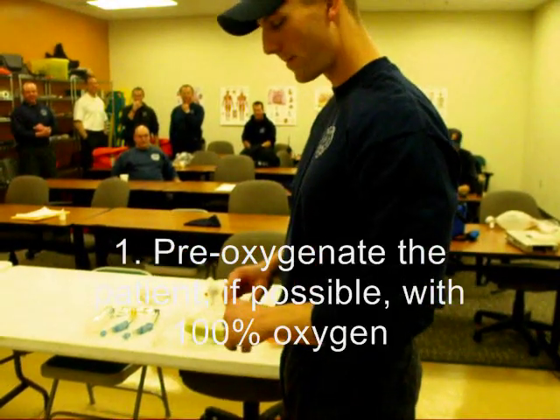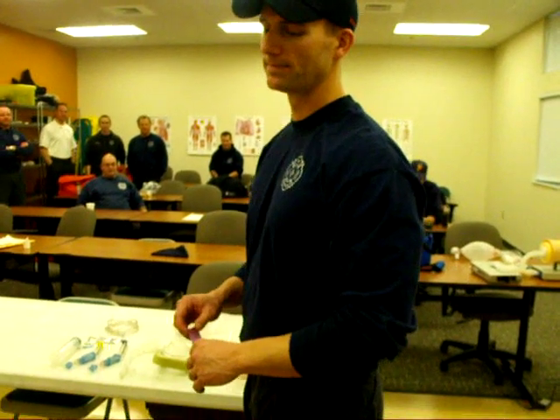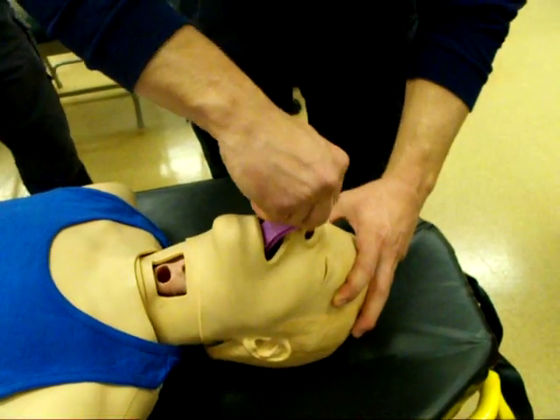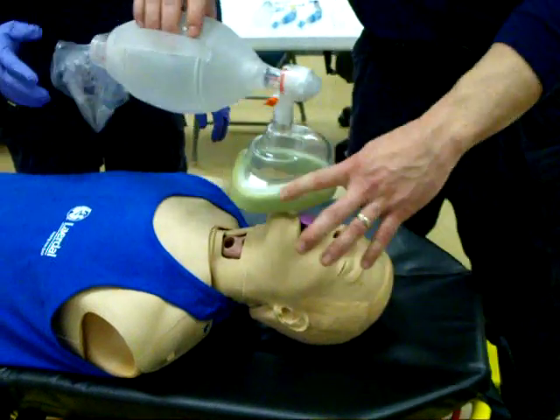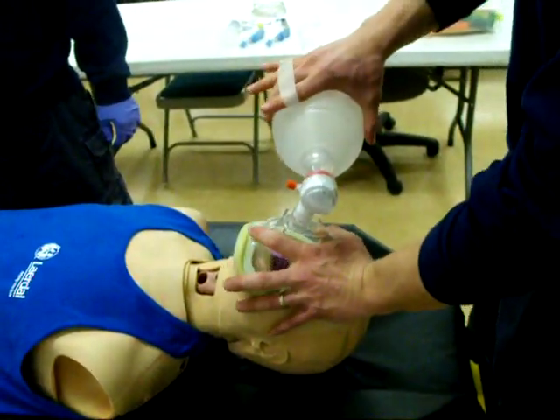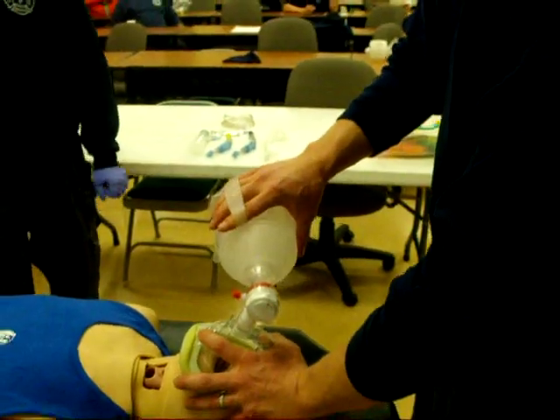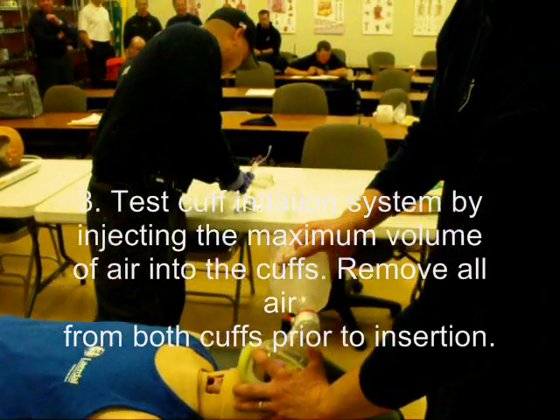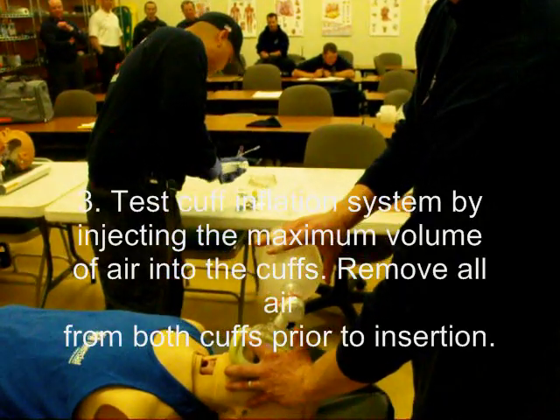Pre-oxygenate the patient with a bag valve mask with 100% oxygen while assembling equipment. Test the cuff inflation system by injecting the maximum volume of air into the cuffs. That would be 60 cc's. Ensure that you remove all air from both cuffs prior to insertion.